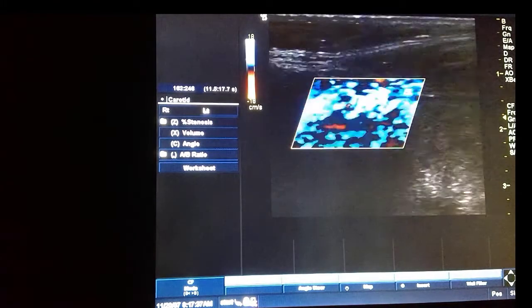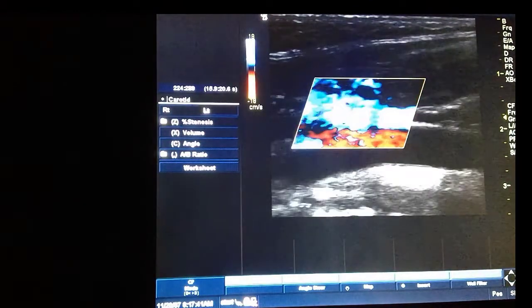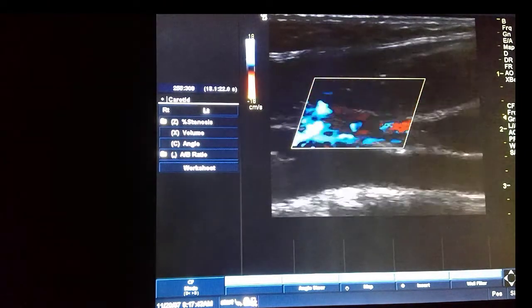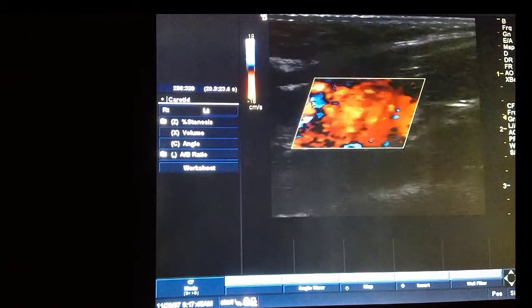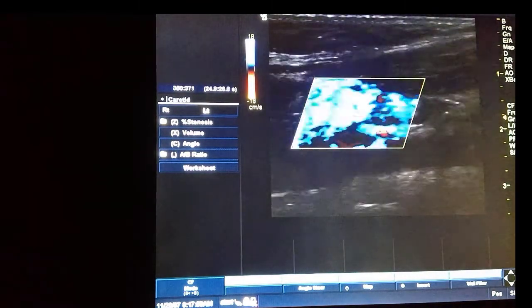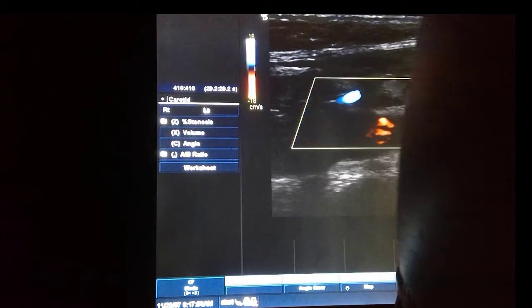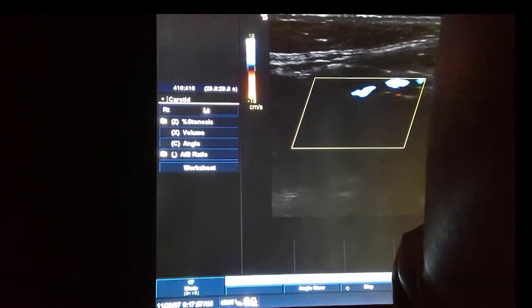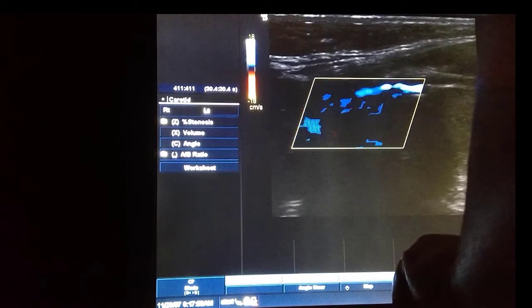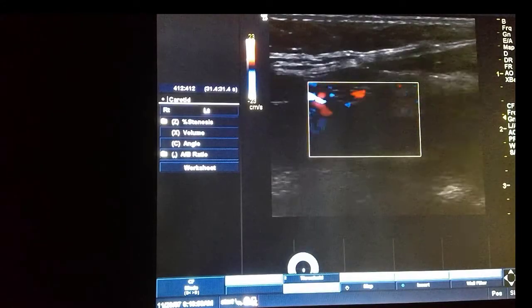So it's not uncommon for a sonographer to set their settings with a little bit of aliasing to maybe pull that fast moving blood to their eye, but then they might adjust some settings to get that nice solid color later. So I want to just kind of show you how that works. Let's change our angle here and get set up again on the vessel.